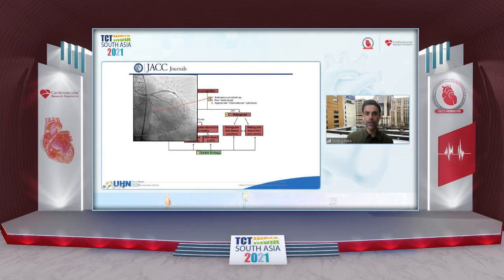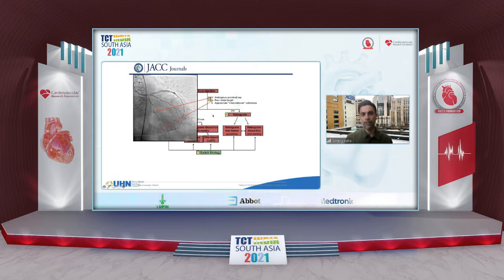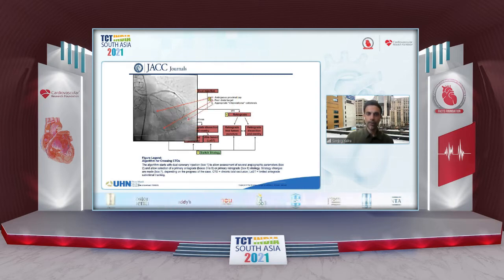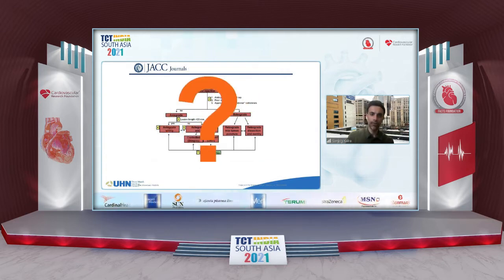So in this situation, there was clearly an ambiguous proximal cap. That would suggest against antigrade and go to retrograde. But then there was a poor distal target. So that would go against retrograde and say, let's try antigrade. And then there were appropriate interventional collaterals for some people, but they were largely epicardial. So that would maybe suggest retrograde for some or antigrade for others, right? So how do we get clarity here?